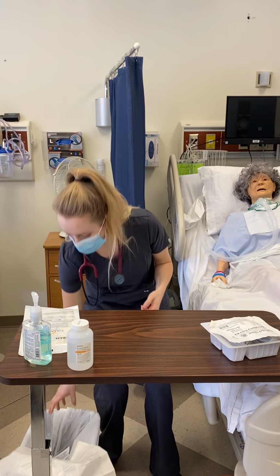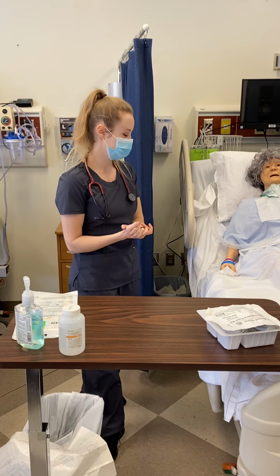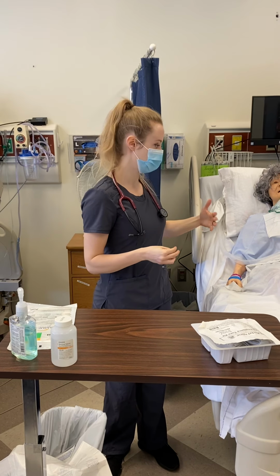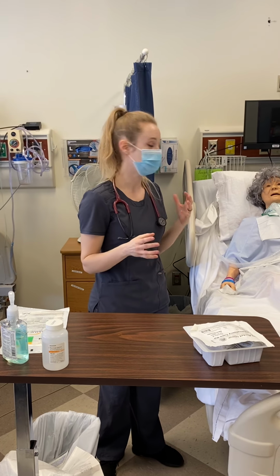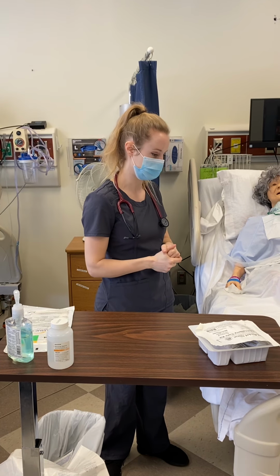And I want to have an obturator and a trach that is one size smaller than the one I currently have in case my patient coughs and ejects the trach from their site. I will also want to have a bag on hand so that I can bag my patient if they are in distress or eject the tracheostomy from the site.